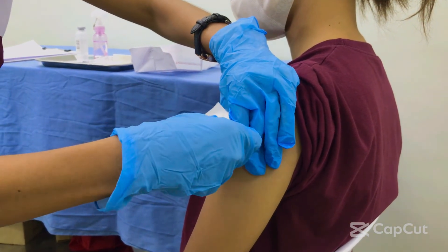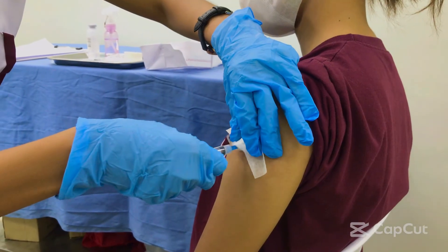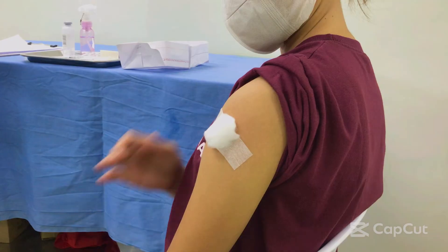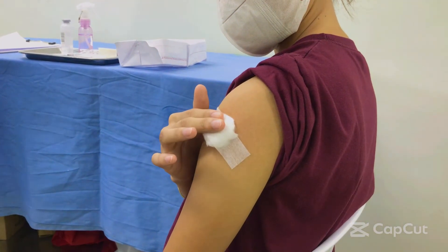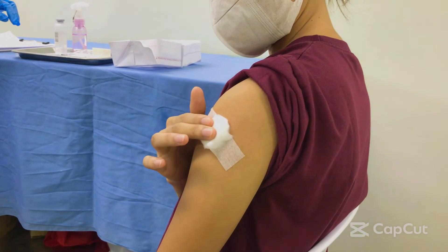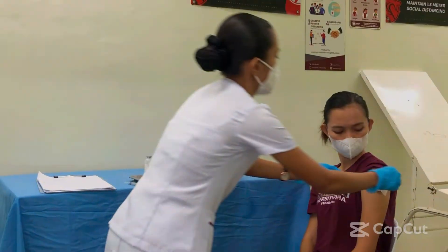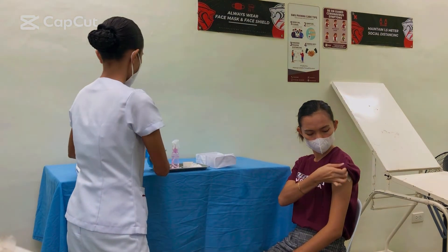Withdraw the needle while applying an alcohol swab or gauze gently over the site. Apply gentle pressure. Do not massage the site. Apply a bandage if needed. Help the patient to a comfortable position.